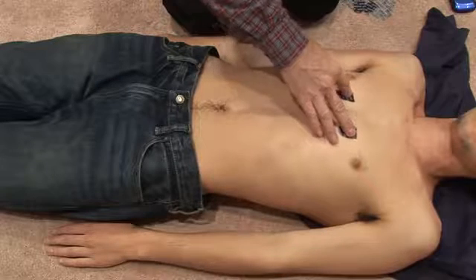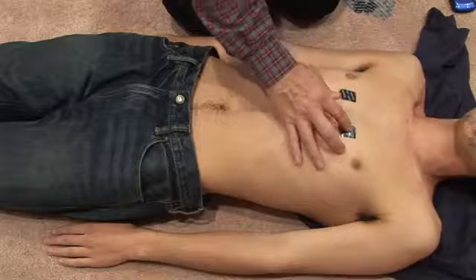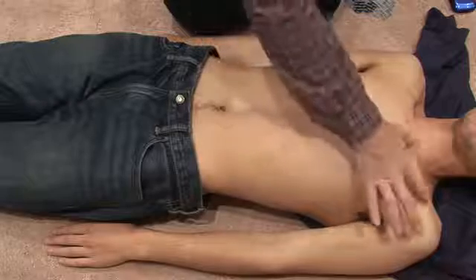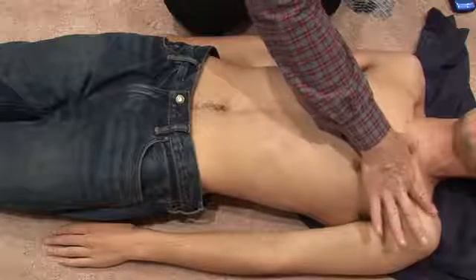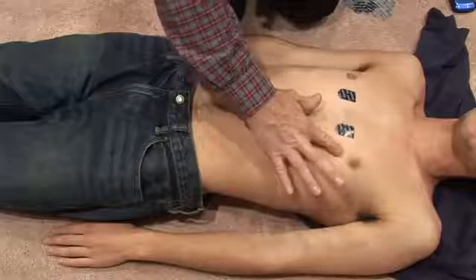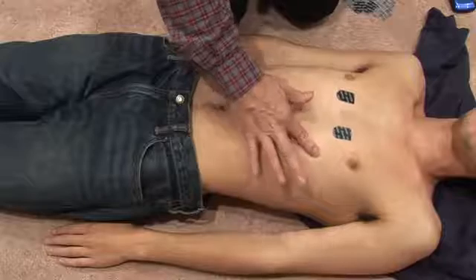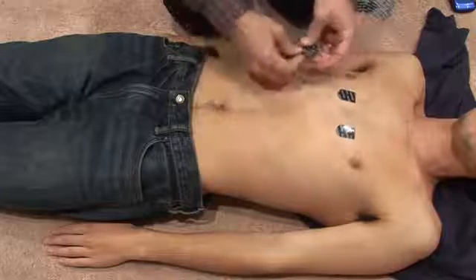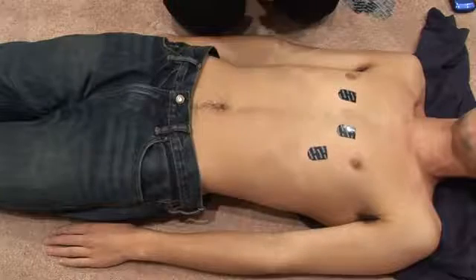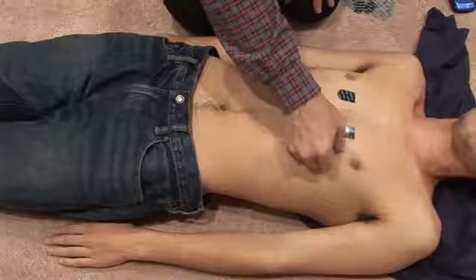The next place to look for is V4, because V3 is going to be midway between V2 and V4. V4 is supposed to be in the mid-clavicular line. So find the clavicle, find the middle of the clavicle, and run down. And it's supposed to be not in the fourth intercostal space, but the fifth intercostal space. So V4 goes right here. Now V3 will wind up going halfway between V2 and V4.